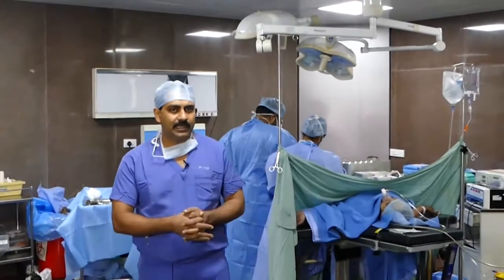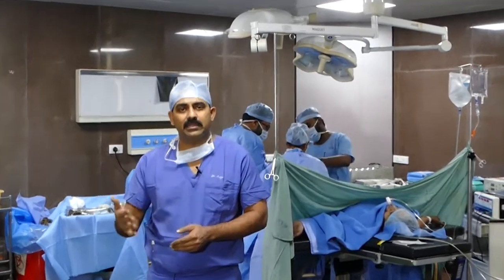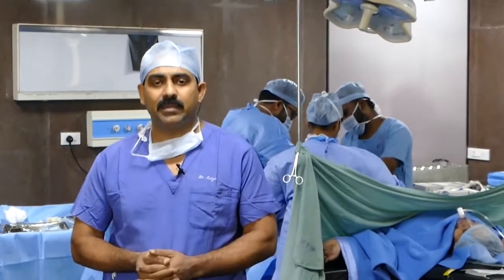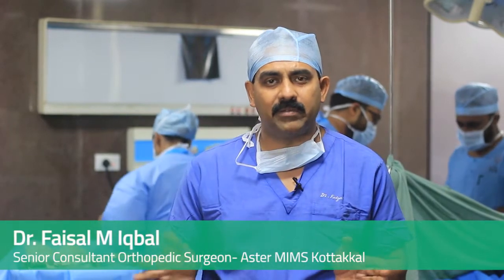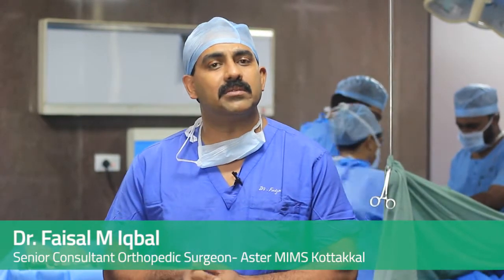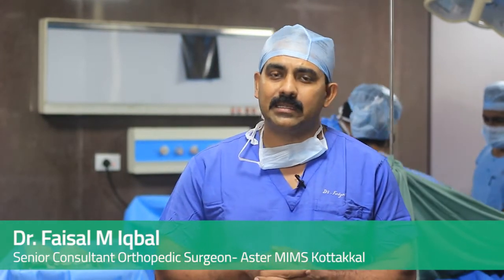Once the patient is in the theatre, the patient is again evaluated for all the parameters like blood pressure, and the patient is induced for surgery by the anesthetic team. Local anesthesia is given only for the limb we are operating on, and the patient will be wide awake during the surgery, and we can communicate with the patient. If the patient is a little apprehensive, we can make the patient a little sleepy by giving sedation. This is what the anesthetic team does before the surgery.